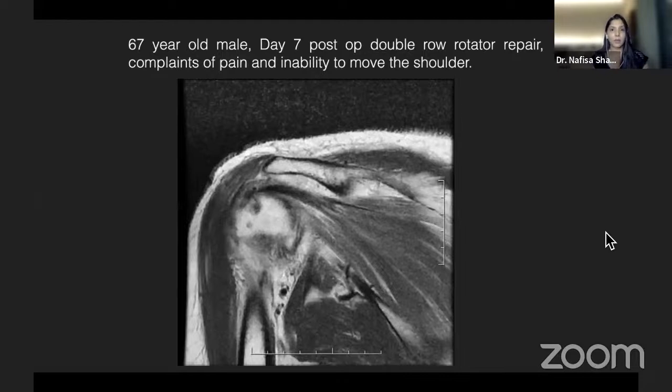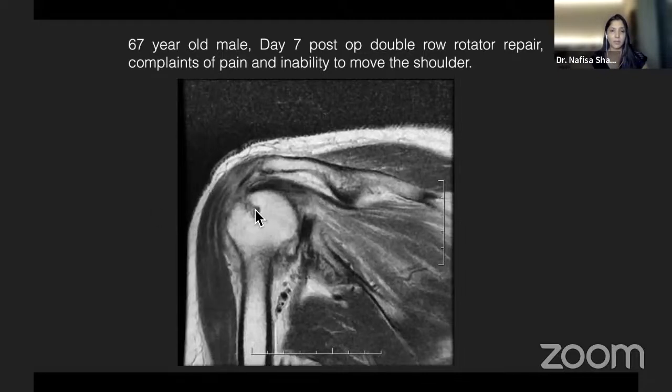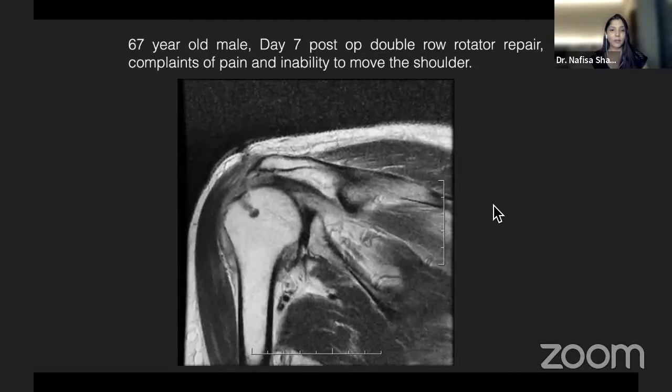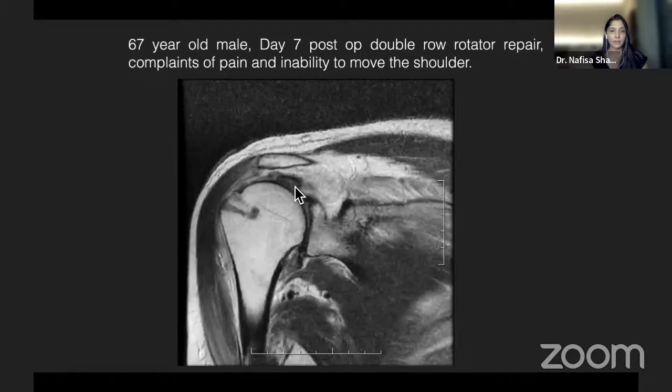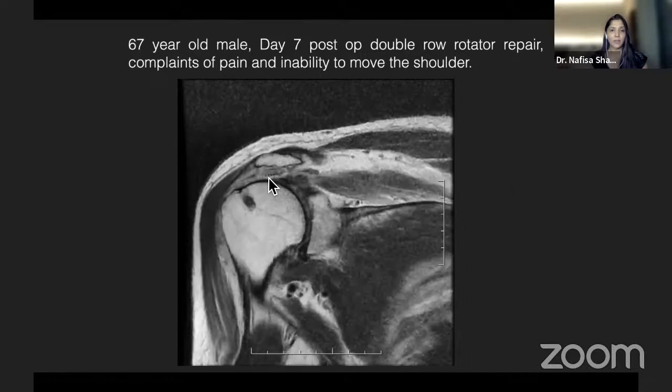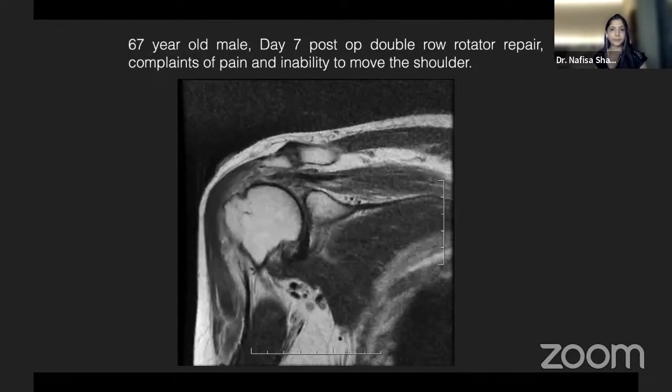This was a double row rotator repair. You can see that one set of anchors is in place, but as we move a little further, you will see that the cuff has retracted, and this is because some of the anchors have flown off, and this is a case of rotator cuff repair failure.